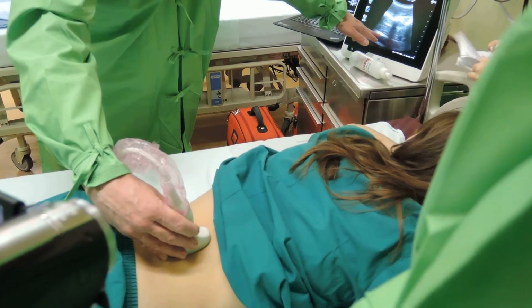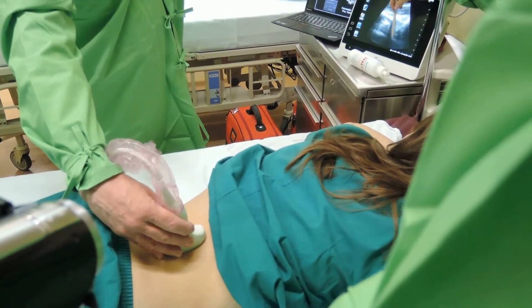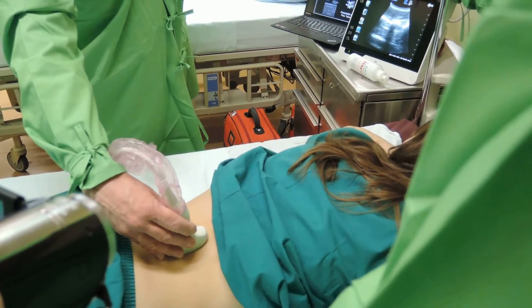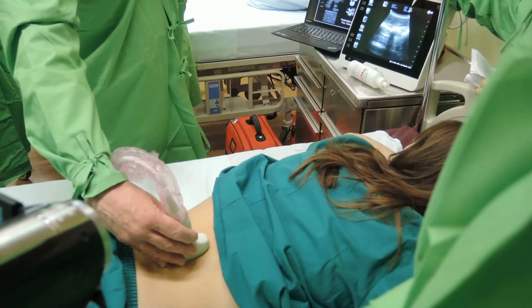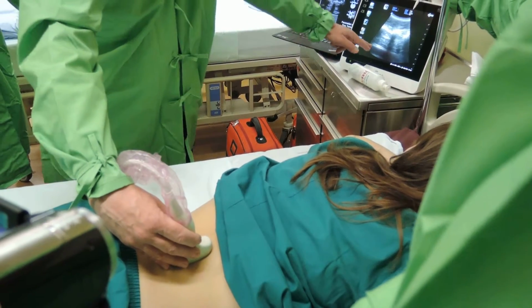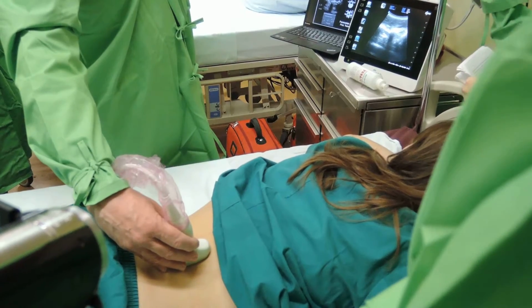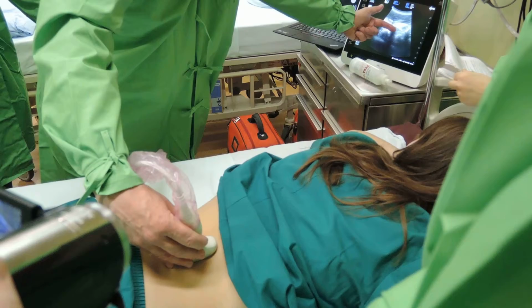There is the peritoneum, and there's already the abdominal cavity. The girl is thin, and we can see deep and well. The vena cava can already be seen in her case. She is so thin that even the inferior vena cava is visible.